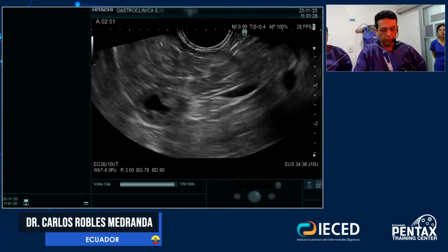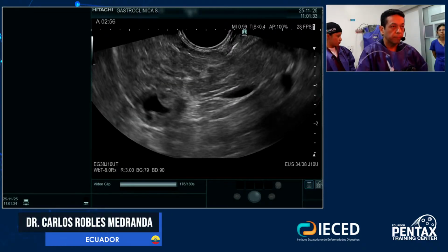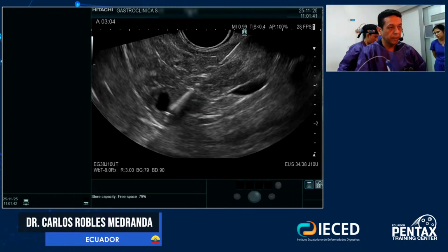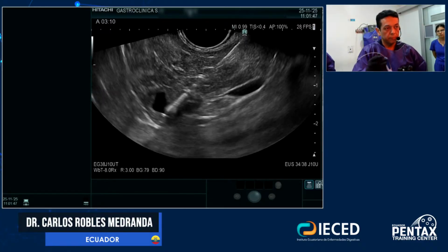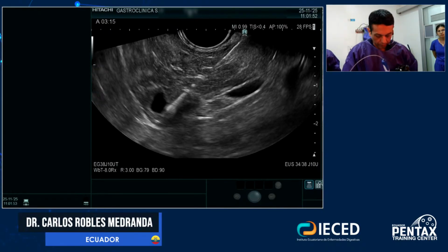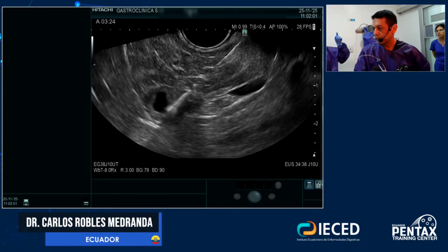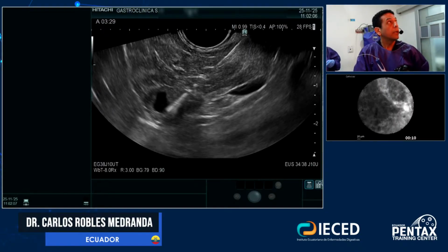I need to be very straightforward. Okay, now I am inside. You can see very well my needle. And now le podemos pasar el okay. So now we pass fluorescein, and now I am looking inside. So confocal, okay, en grande.